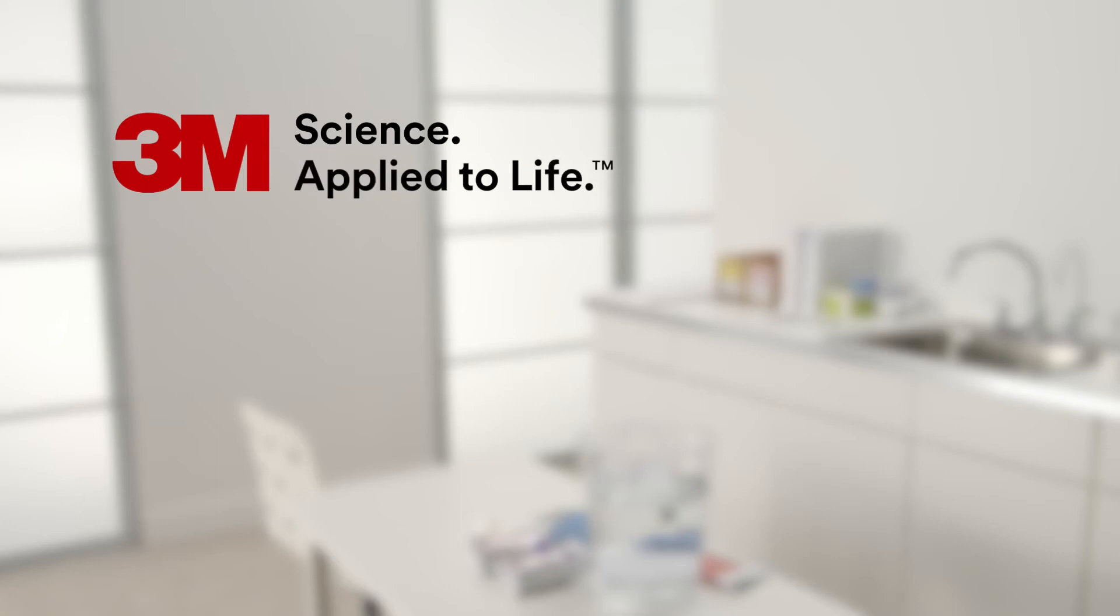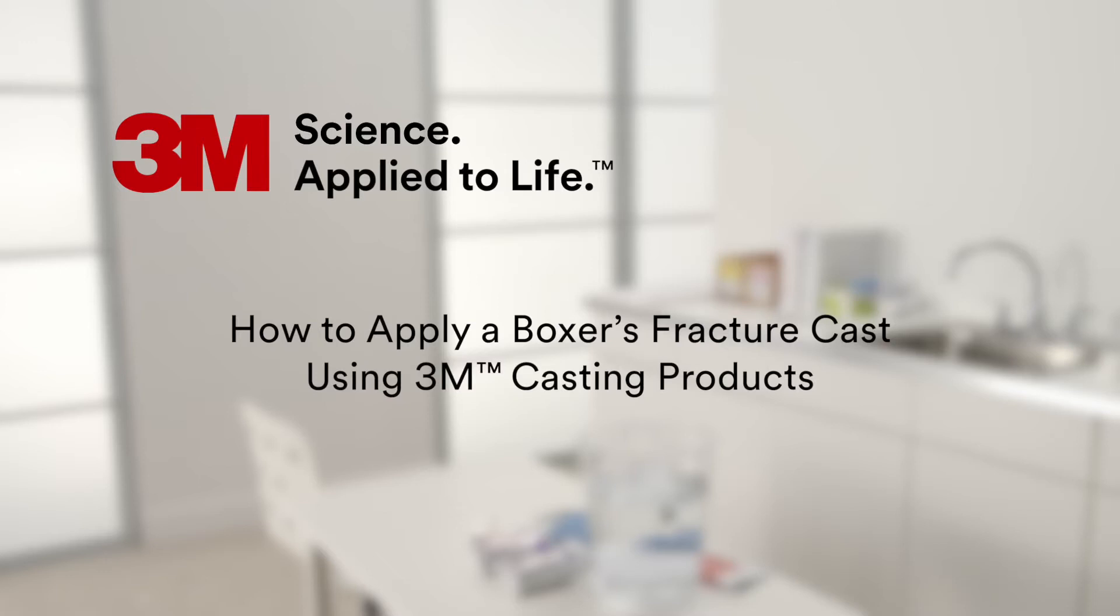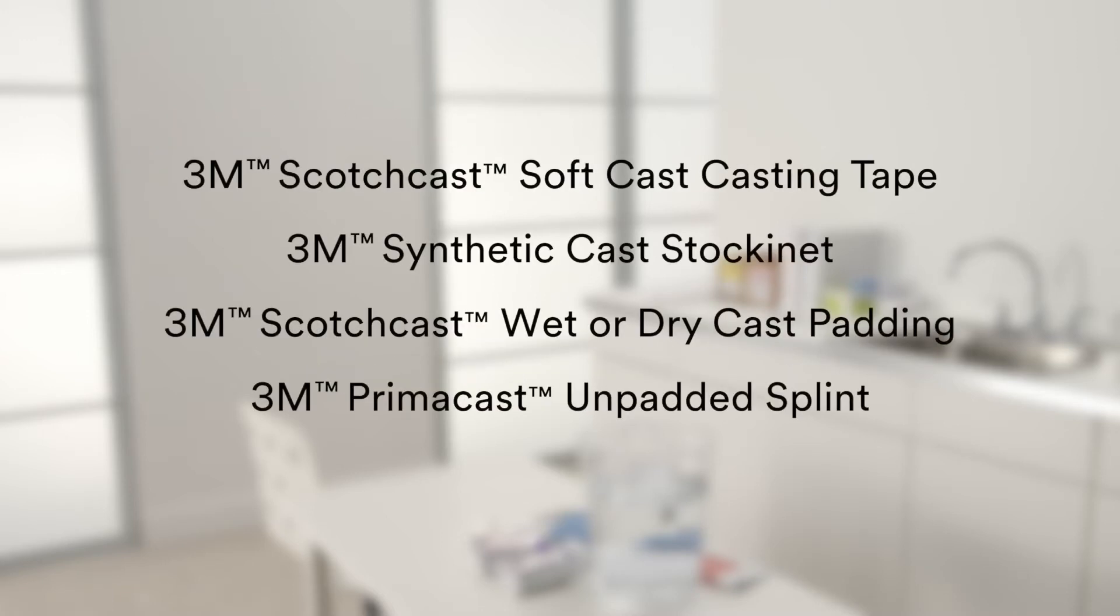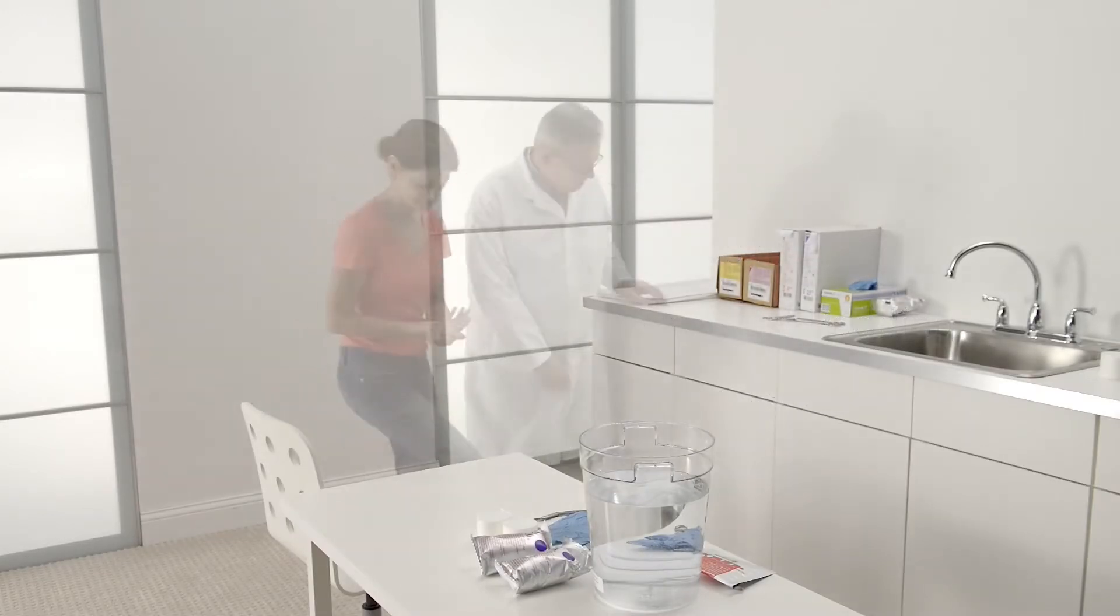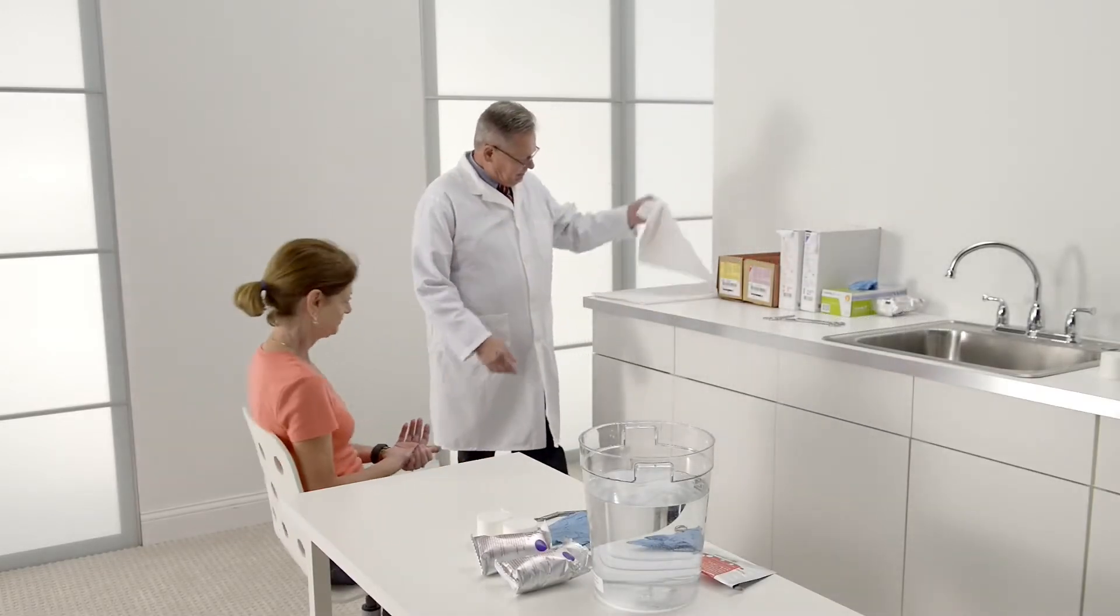This tutorial provides step-by-step instructions for casting a boxer's fracture using 3M Casting products. Begin by gathering the supplies you'll need. Keep your supplies within easy reach during cast application.